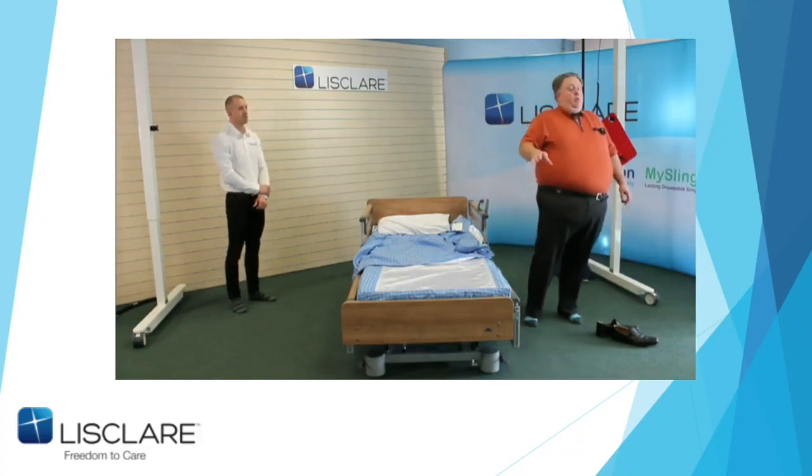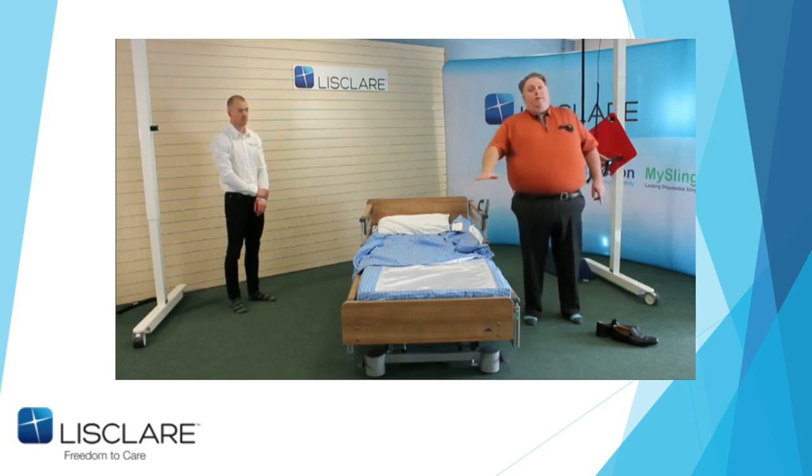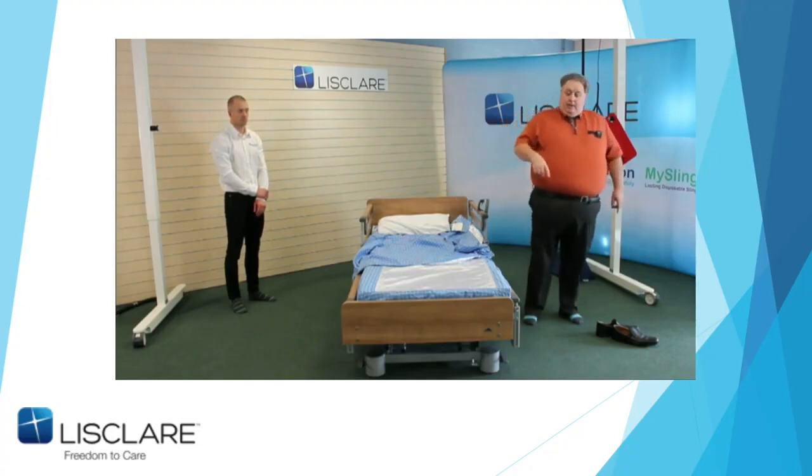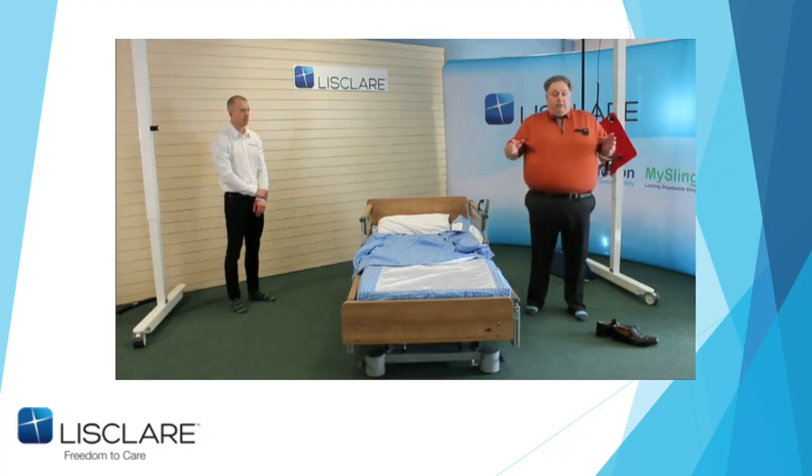On all good quality air mattresses, and I would say most of them now have it, there is a static button. And that static button is for you to do manual handling. So when you press it, the air mattress becomes firm for manual handling for 10 minutes, and then switches itself back off to alternating. It's in the instructions, but for some strange reason, a lot of that gets lost in translation.